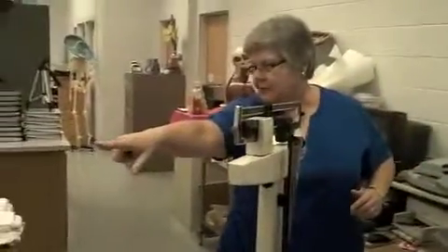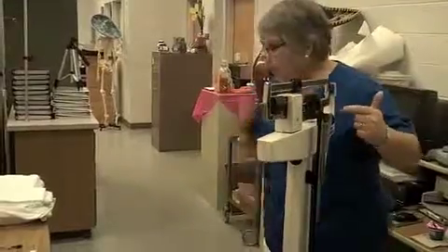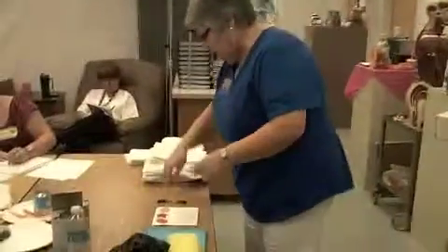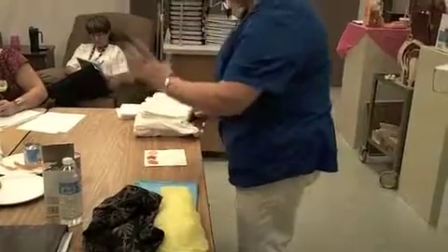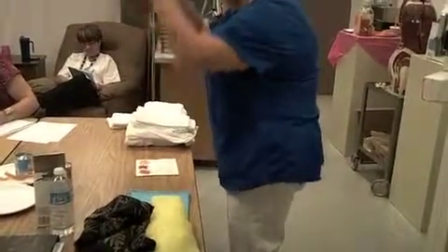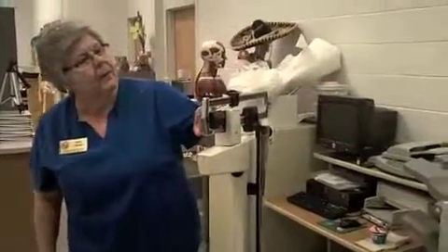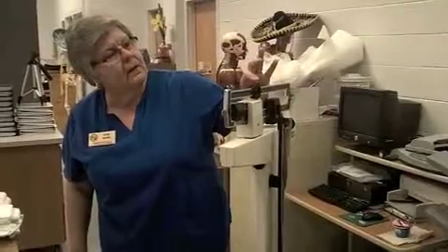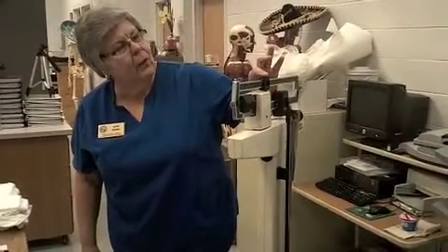Get the patient safe, wash their hands, come back over, take their bottom number, go to their paper, wash your hands, write that bottom number down over there to the side. There's a big margin on both sides of that piece of paper. Then come up here to the top. And it looks like it is 18, 19, it looks like it's 19 3/4.